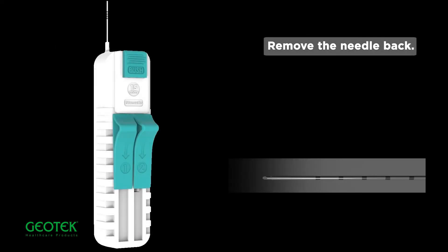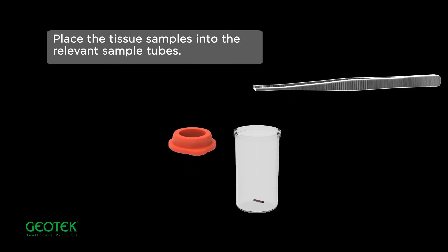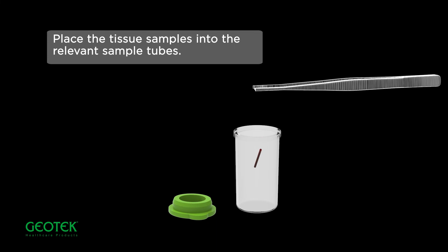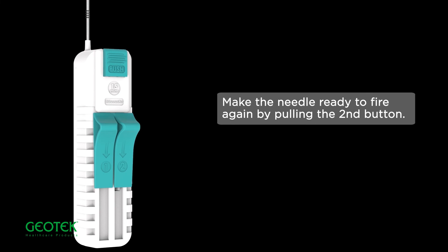Remove the needle back and retrieve the sample from the biopsy chamber by pulling back Button 1. Place the tissue samples into the relevant sample tubes. Make the needle ready to fire again by pulling the second button.